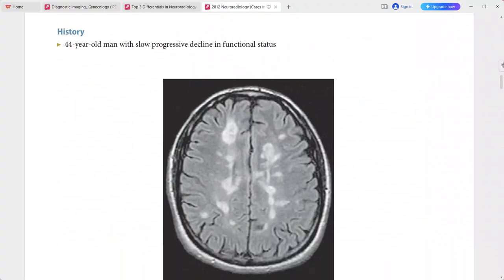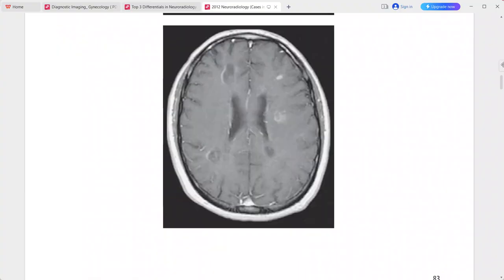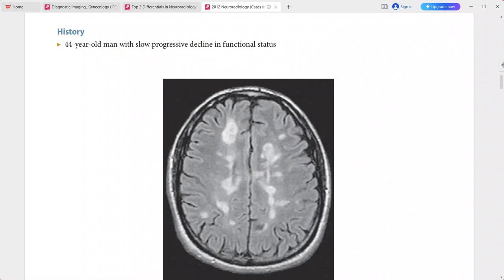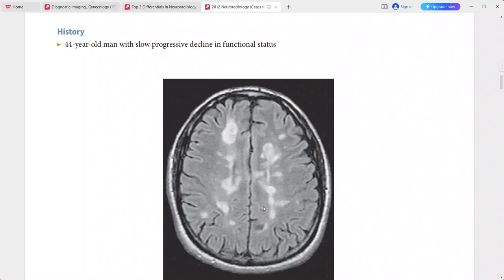Next: a 44-year-old man with slow progressive decline in functional status. FLAIR shows numerous large hyperintense lesions in the bilateral deep white matter, many with a long axis perpendicular to the surface of the ventricles. There is little mass effect associated with these lesions.